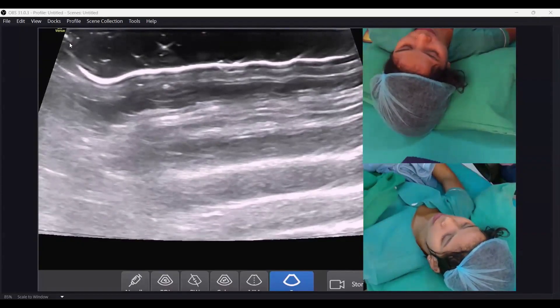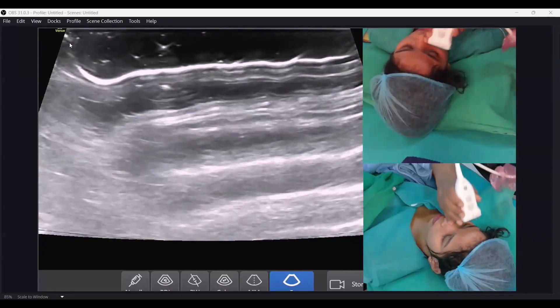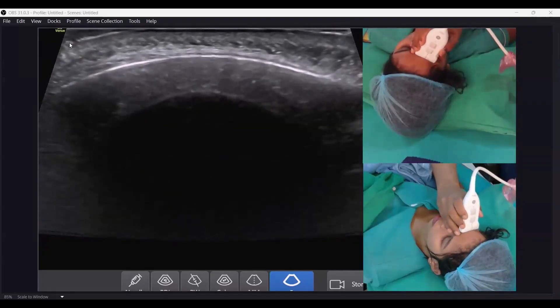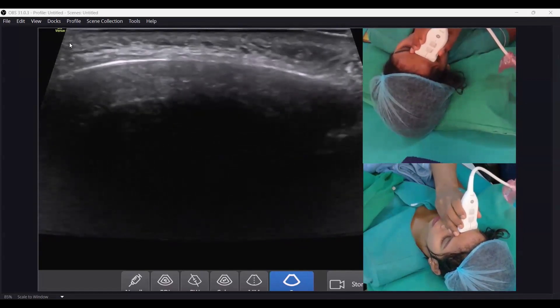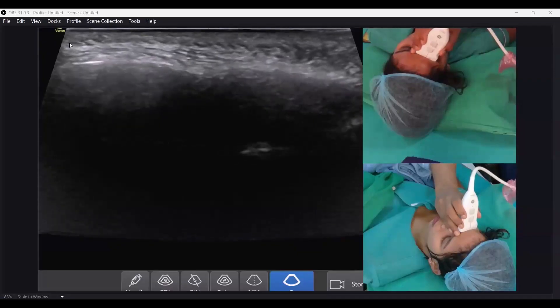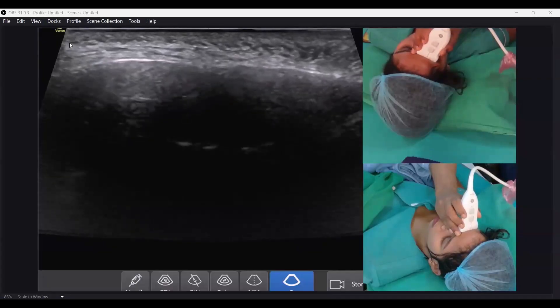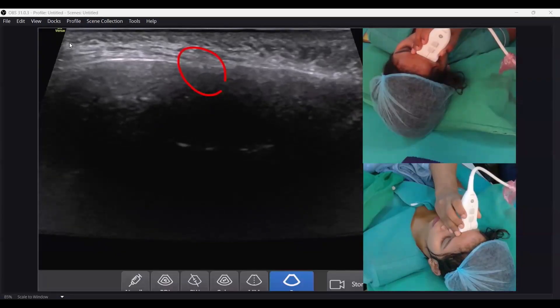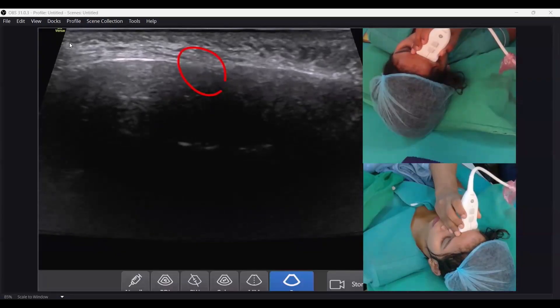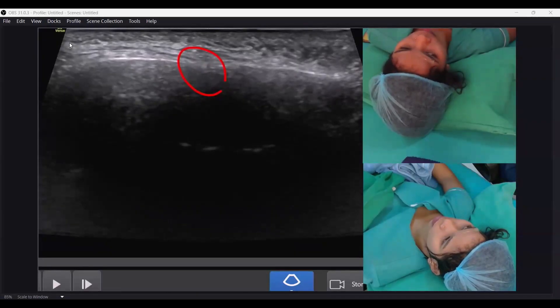I am putting the aspect marker on the lateral side, meaning the left-hand side of the screen is the lateral side. This is the bone and I am just coming down to search for the break. So that is the break, and you can see the pulses also — most of the time you will be getting pulses. This nerve is not seen here, but the blood vessel is seen most of the time. So that is the blood vessel.